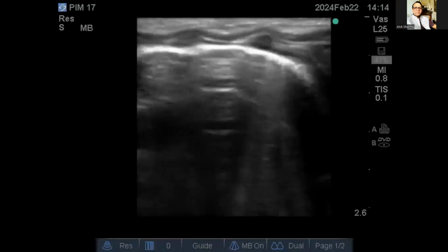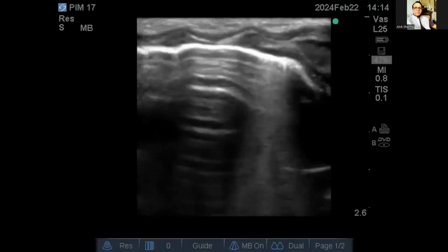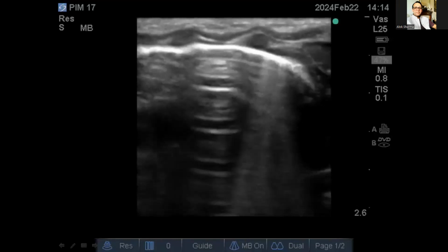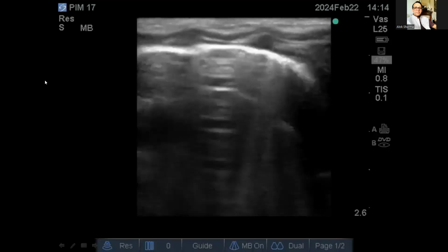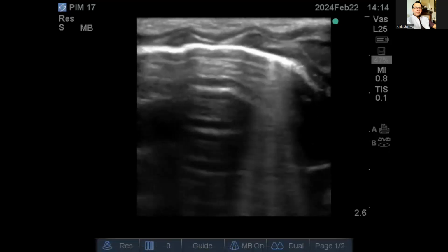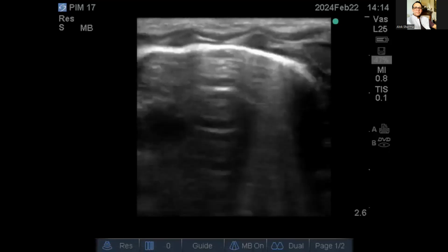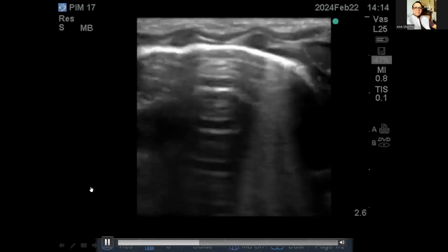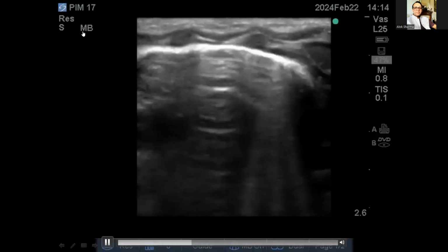And what I'd say is that, again, I don't think it would be unusual for somebody to have given this baby surfactant, either INSURE or LISA, if the baby has good efforts, versus not. I would say it's also within remit to say that you could have waited and done another lung ultrasound, maybe an hour later. And again, if the lung ultrasound score is deteriorating, you have worse clinical appearance because the baby's FiO2 is rising, then you bail out. So there's always the remit of doing serial lung ultrasound.